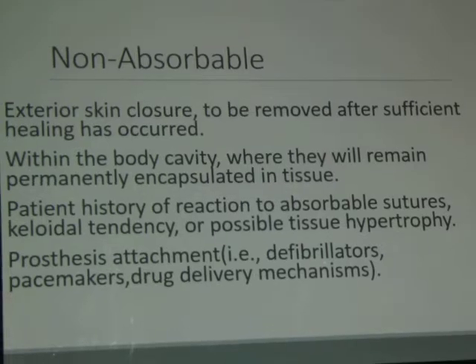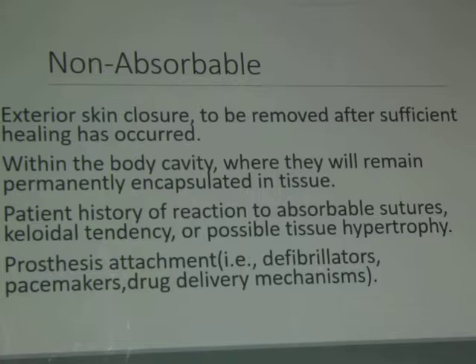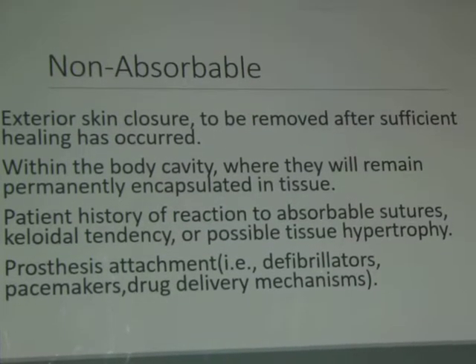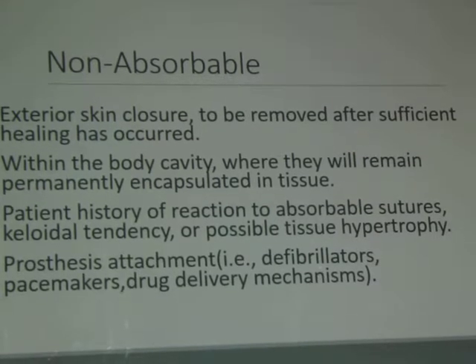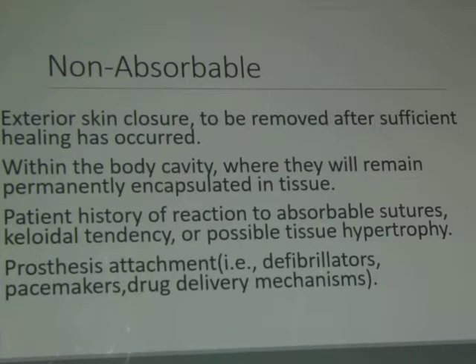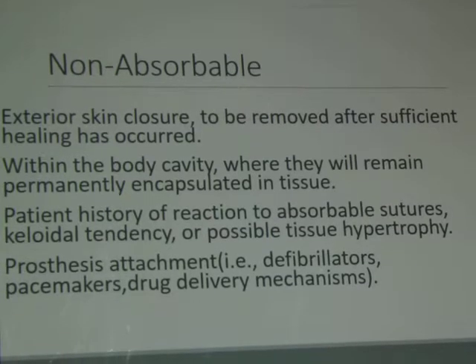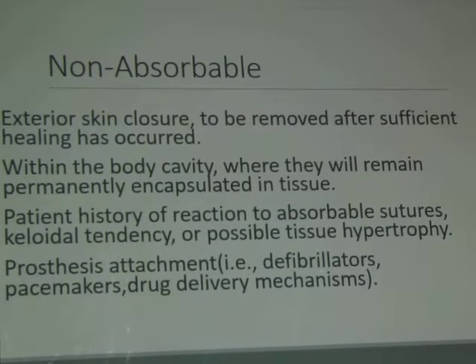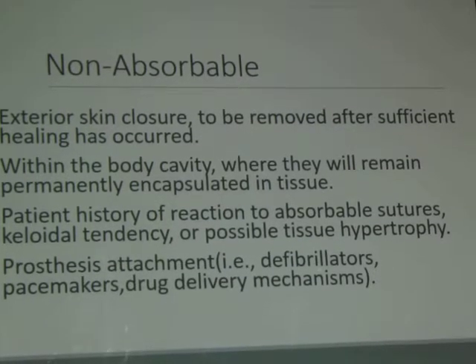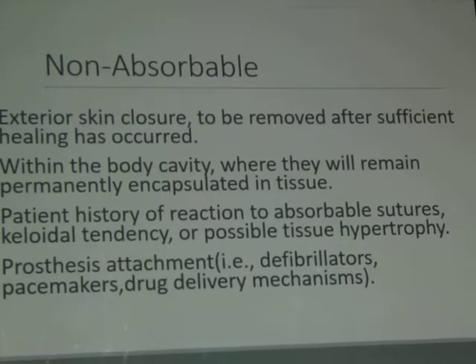I don't want the tissue to move forever. عشان كده أي حد منكم شاف عيان عامل open heart surgery وعمل له chest x-ray بيلاقي إيه؟ بيلاقي السلوك اللي قافلين بيها الsternum because I cannot afford the sternum not to heal. رقم واحد it's extremely painful for the patient. يعني كل عيان بتوع الopen heart لو أي حد منكم شاف عيان عامل open heart هتلاقيه لابس كورسي استيك عشان ما يحصلش movement في البون.